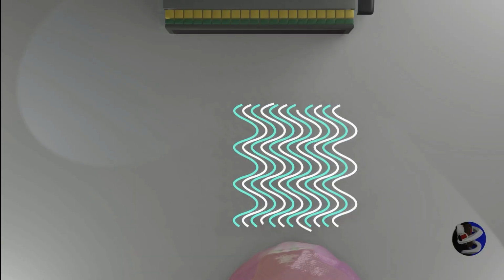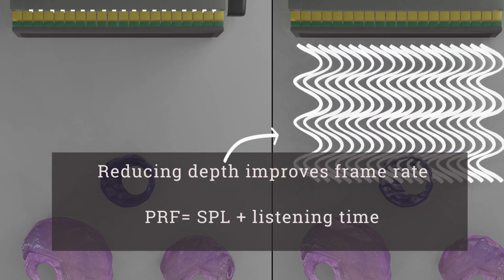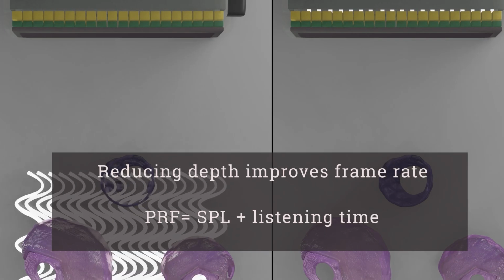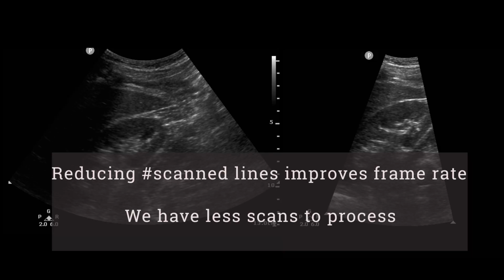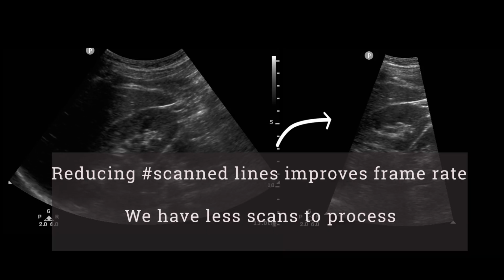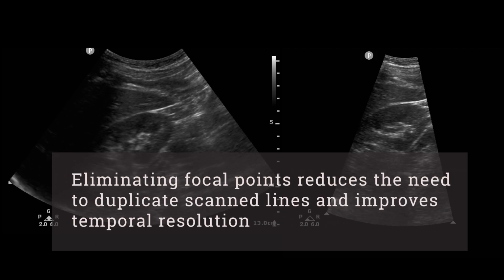Factors that improve your frame rate include the following: reducing the target's depth. Pulses need to travel less distance, and it is faster for the machine to process a frame, so we want a high pulse repetition frequency. Remember that the listening time increases with depth. The less listening time, the higher the frame rate. Next, reducing the number of scan lines. Temporal resolution can also be improved by picking a reduced number of scan lines per frame, since there are fewer scan lines to process. Eliminating focal points. Reducing the number of focal points reduces the need to duplicate the scan lines.